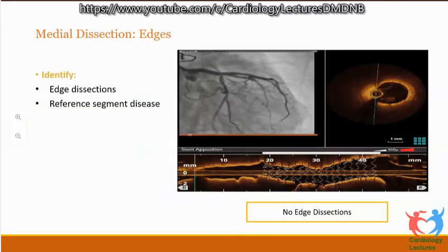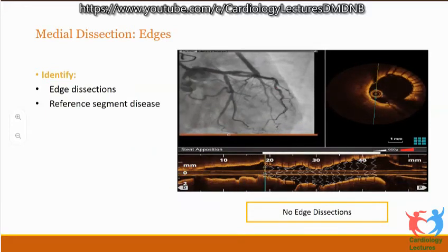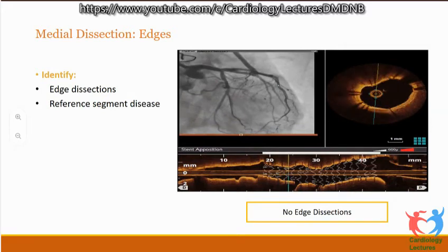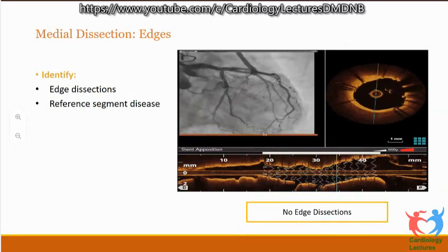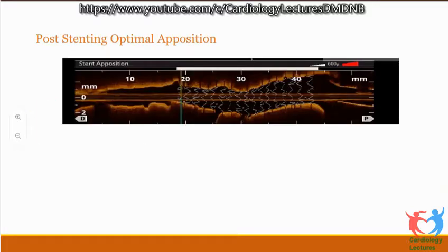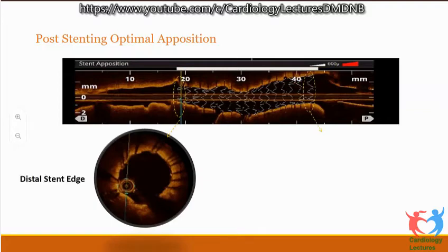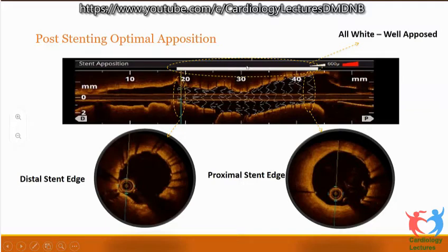So we went ahead and did the OCT stenting. The run was taken from distal LAD to the left main. This longitudinal view appears to be very well expanded. There were no edge dissections which were noted. The apposition was just fine. You don't see any malapposed stent struts because the distal edge is absolutely fine. And the apposition indicator showing you that it's all white, so you don't need to worry.